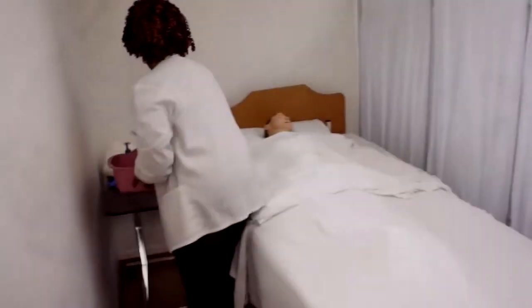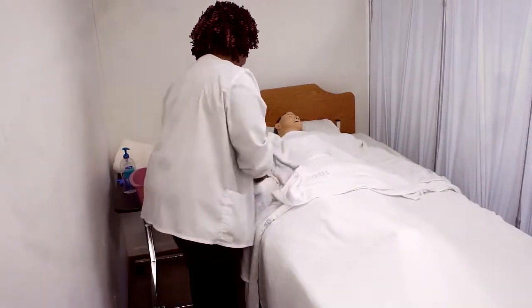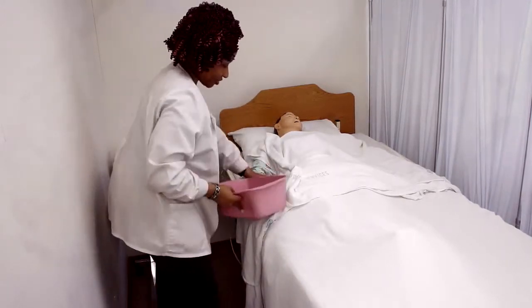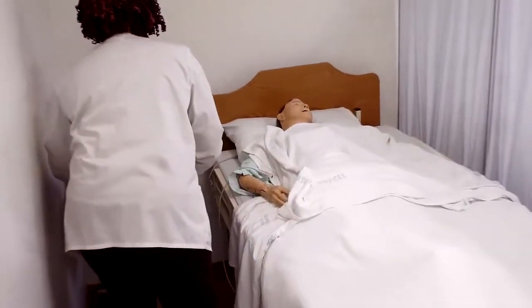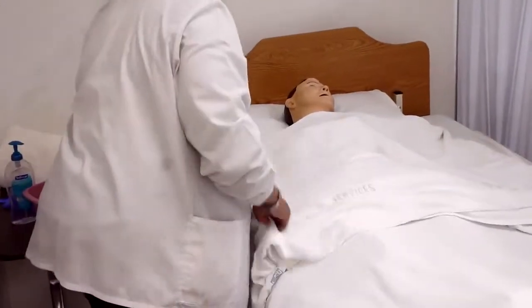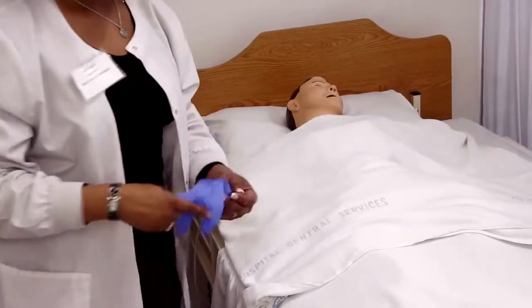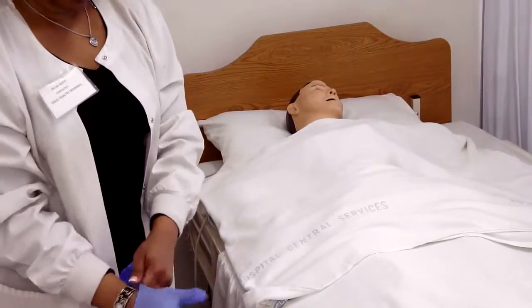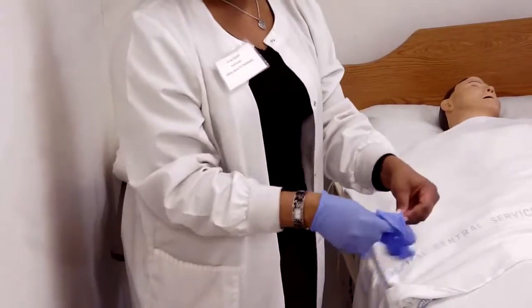So I've tested the water. It feels great to me, but now we need Mrs. Johnson to say it's okay. Go ahead and expose her arm. And Mrs. Johnson, test the water for me. She says the water feels great. Okay. So now that Mrs. Johnson has said okay, now we can go ahead and put our gloves on. If your hands are wet, your gloves will stick.